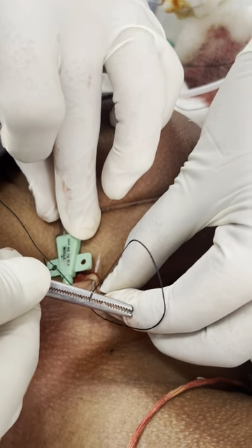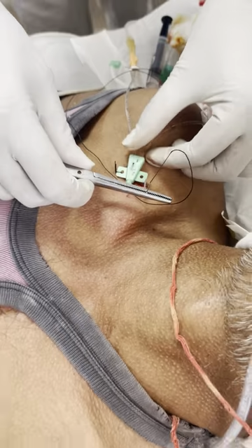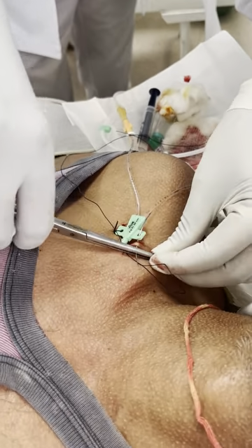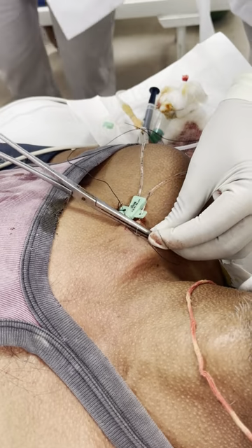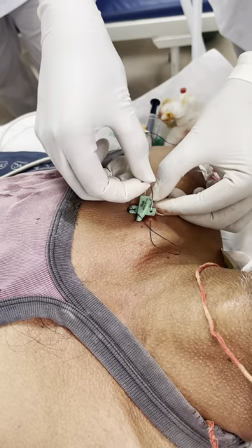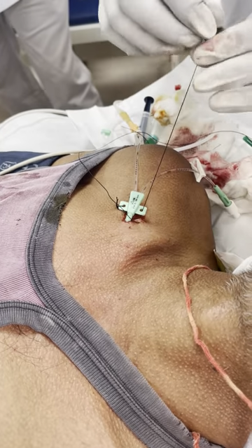When I used to insert central lines, sisters used to give stitches, they were smart enough and trained. Main to stitching apne staff se hi karwa raha hoon, unko interest bhi bahut aata tha.